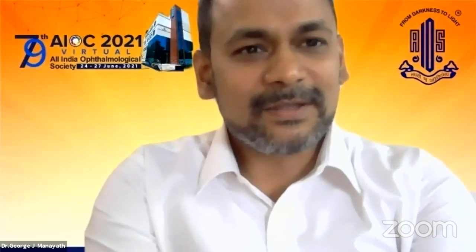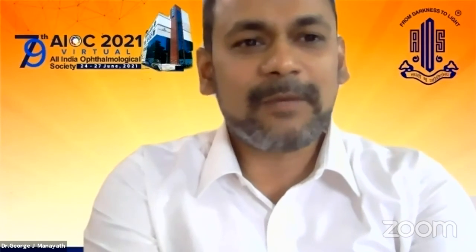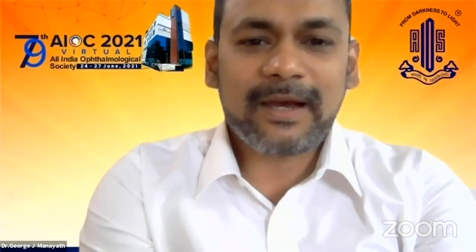For the sake of the delegates, I would like to ask some basic questions. How do you differentiate hard exudate from hyperreflective foci? Dr. Anand, can you just, Anand is here? No, I think Anand is not there. You're talking about hyperreflective foci in diabetic macular edema, for a general practitioner, on OCT.